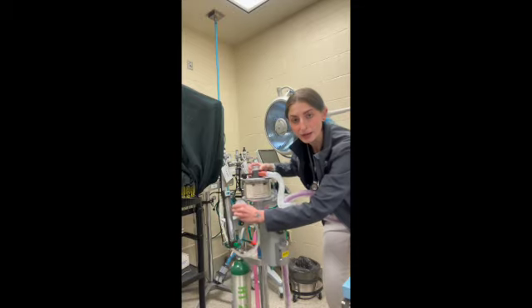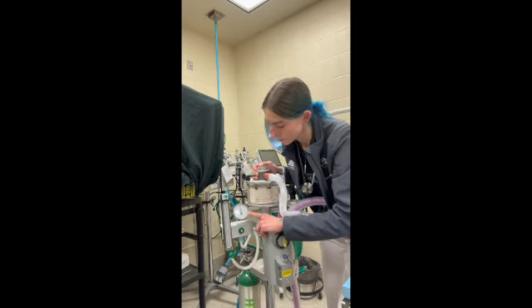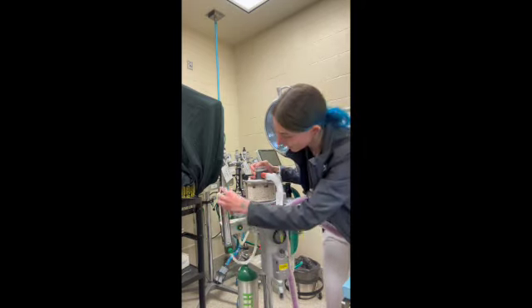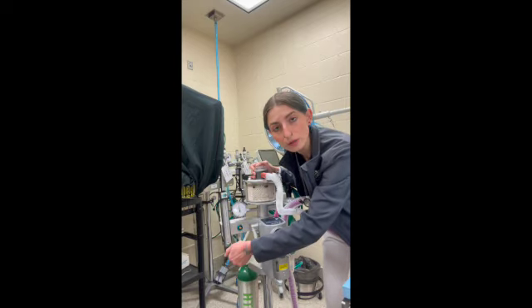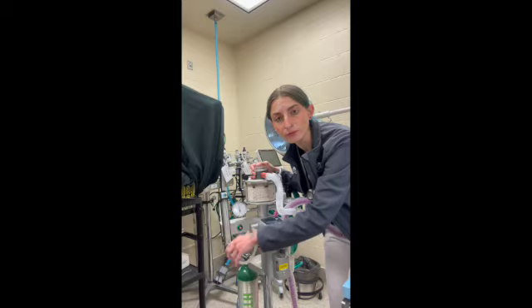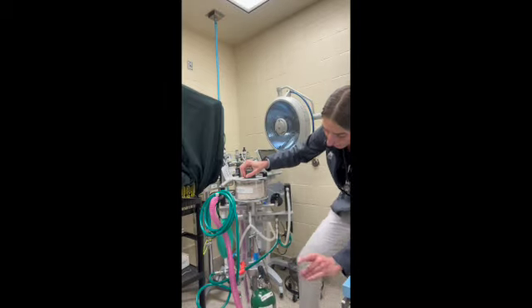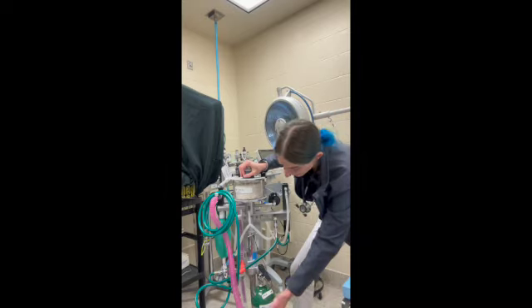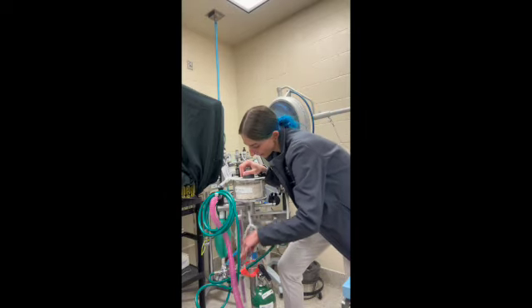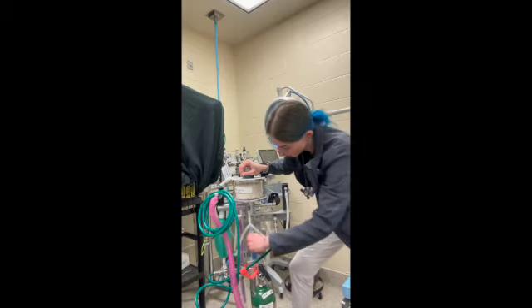Here is our pressure gauge, which measures the pressure in centimeters of water. And then we have our oxygen flow meter that allows us to set our oxygen flow rates. On the back side, we have our oxygen tank, which is connected to a pressure regulator here, and the pressure regulator is connected to the anesthetic machine.